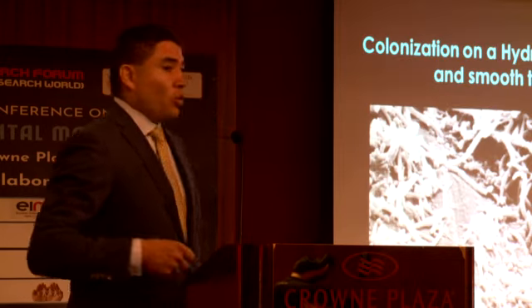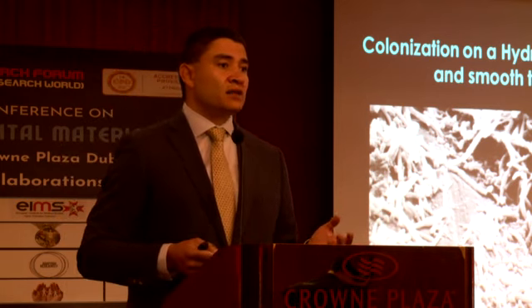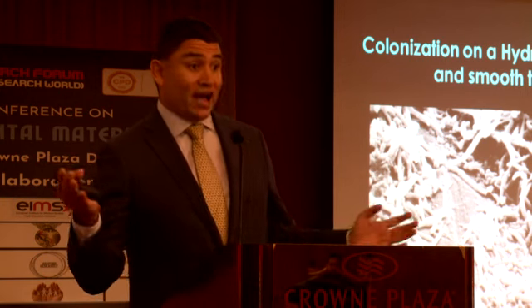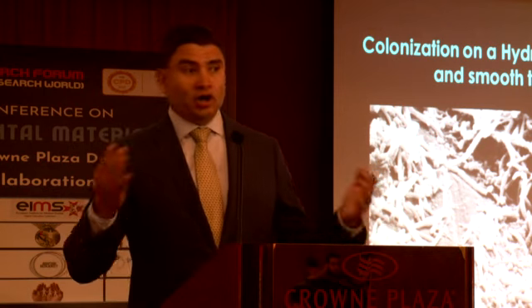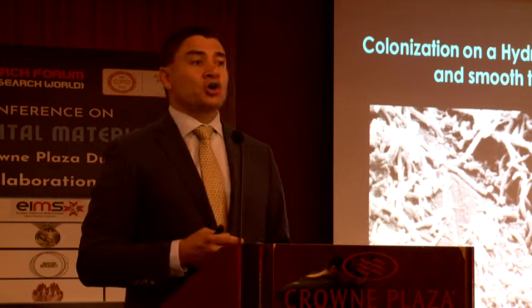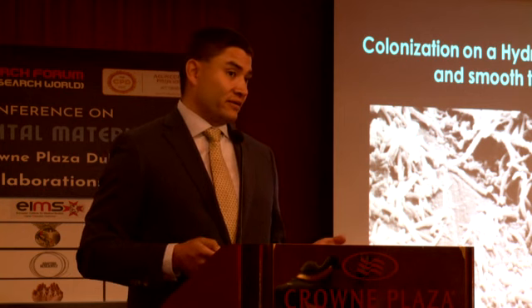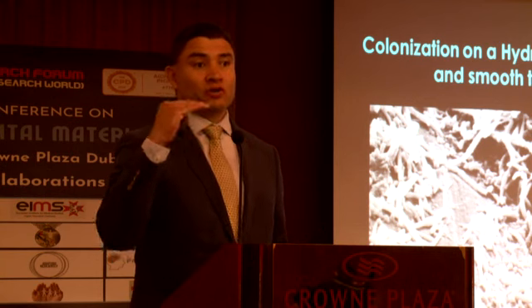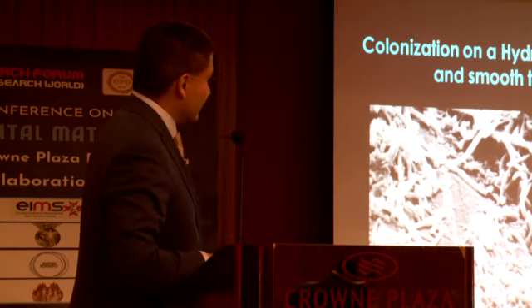Now, most of you place implants with a polished collar or with a roughened surface. I don't know. What's better? Oh, nanotechnology has shown us that roughened surface is better. Yes, better for what? Better for the bone to attach. But what happens when the bone doesn't attach and the roughened surface is exposed to the oral cavity? Well, guess what? This is an example of that.